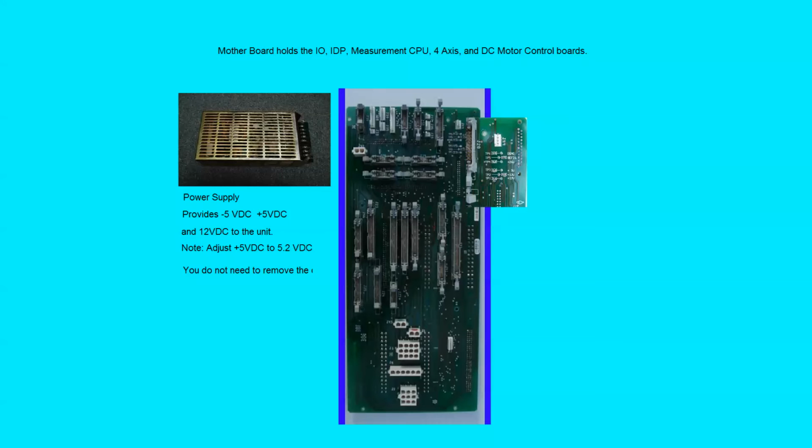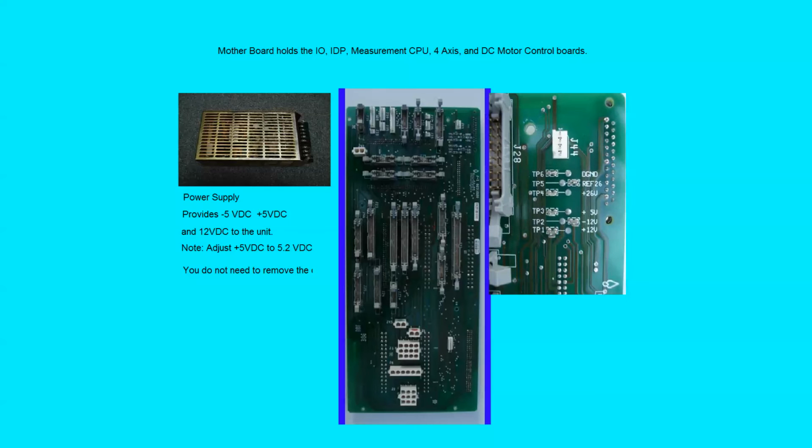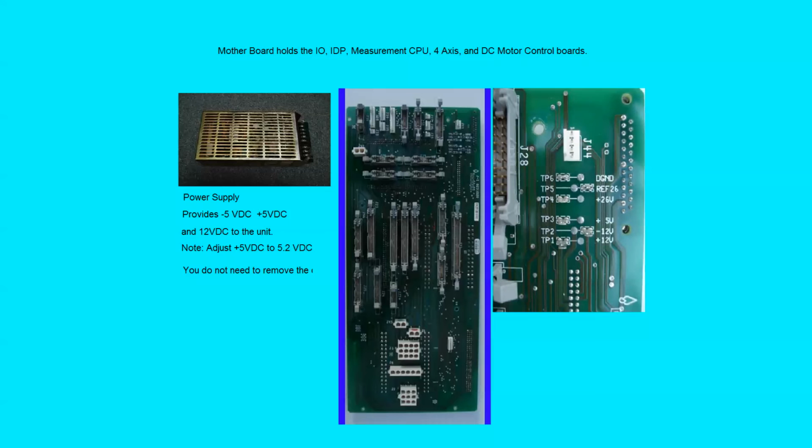The motherboard has a power supply of +5, +12, -12, 26 volts, and 28 volts AC. It has test points on this. TP1 is the +12 volts, TP2 is the -12 volts, TP3 is the +5 volts versus TP6, which is the digital ground. TP4, which is the +26 volts AC, is in reference to TP5.